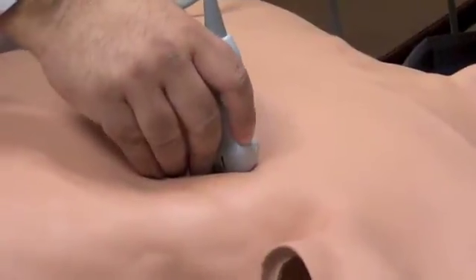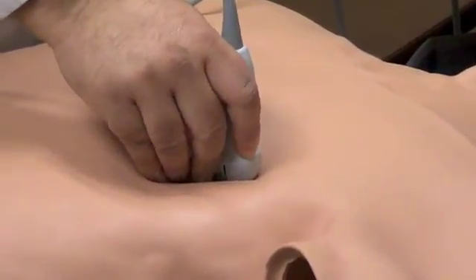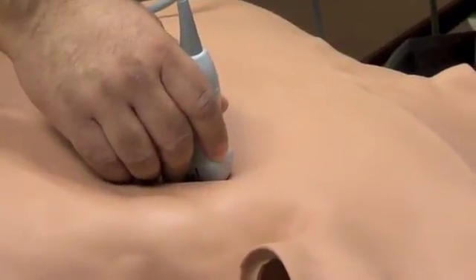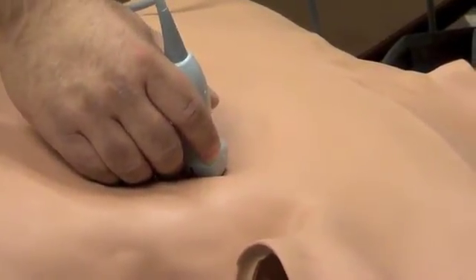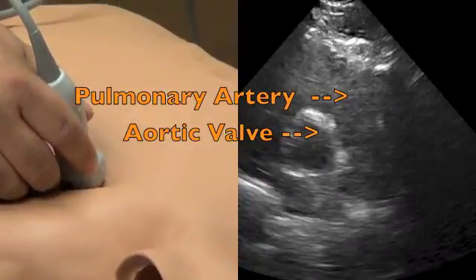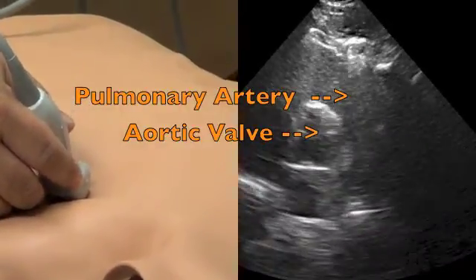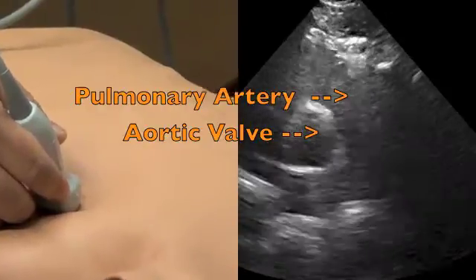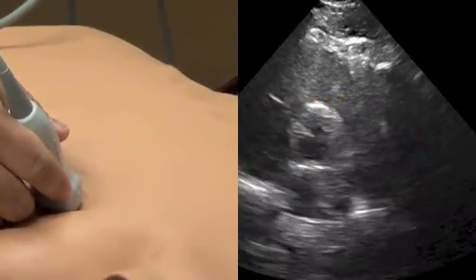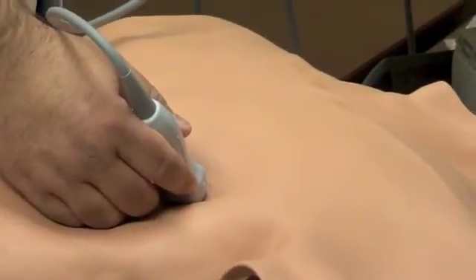From the position of the papillary muscles or the mitral valve, if you slowly tilt your probe towards the base of the heart, you should have the aortic valve in view. If you tilt a little bit more, you should have the window where you can visualize the pulmonary artery. If you have a large embolism, like a saddle embolism, you should be able to detect any abnormalities using this view. Thank you.